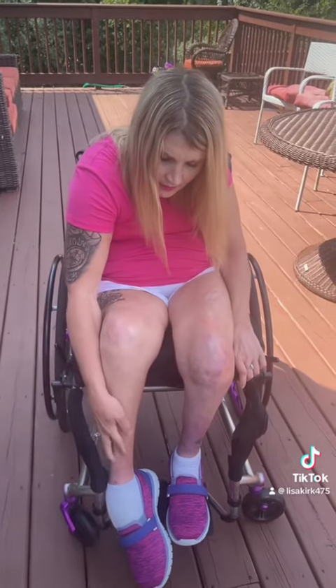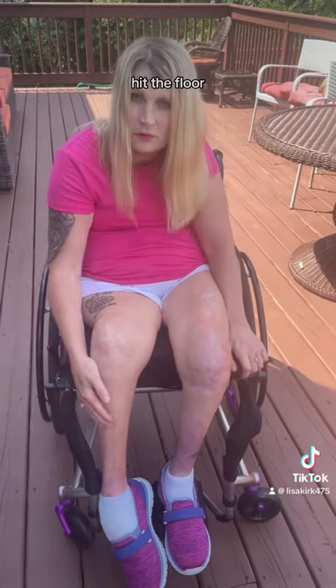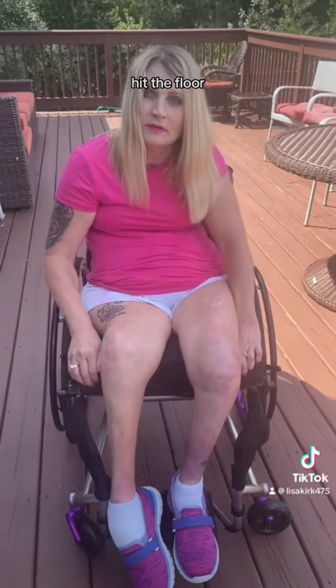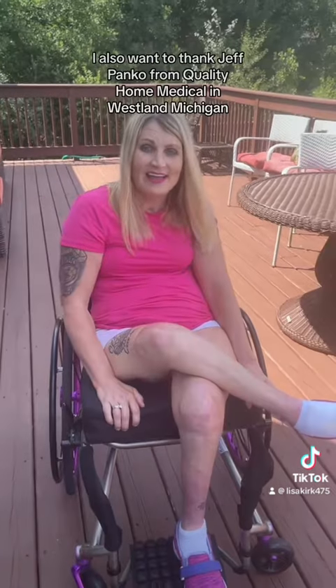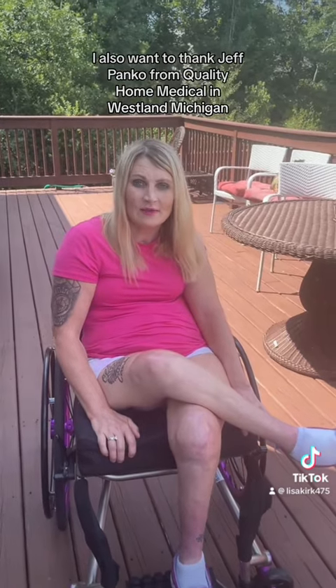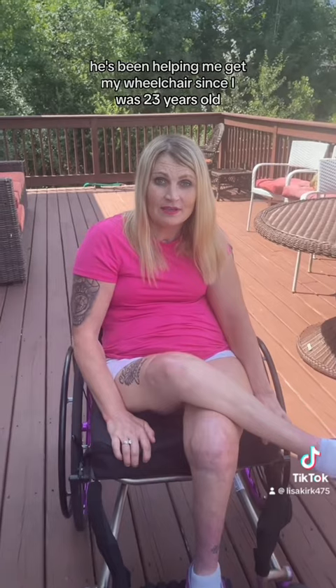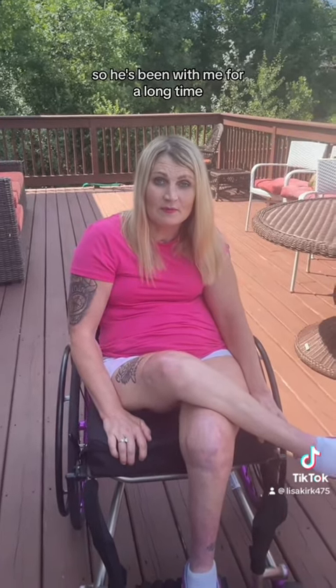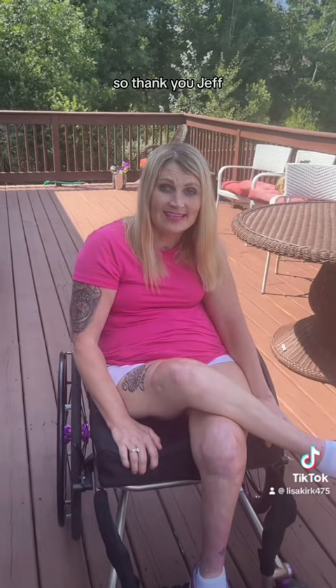Even with my foot drop, it doesn't hit the floor. The chair just fits me better. I also want to thank Jeff Pankow from Quality Home Medical in Westland, Michigan. He's been helping me get my wheelchair since I was 23 years old, so he's been with me for a long time and he's wonderful. So thank you, Jeff.